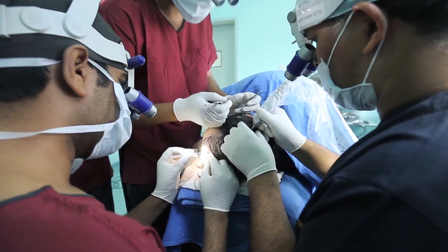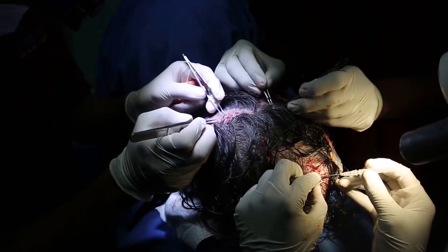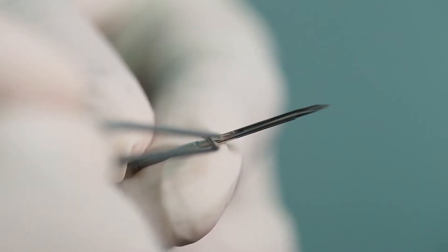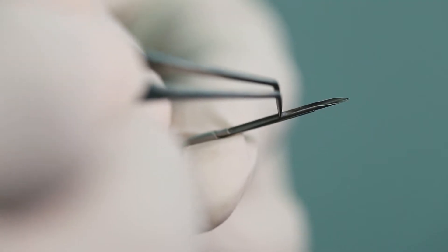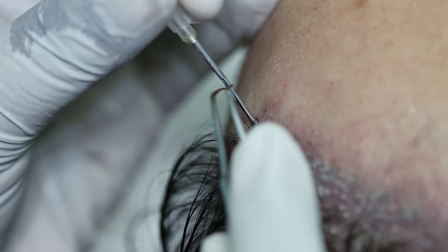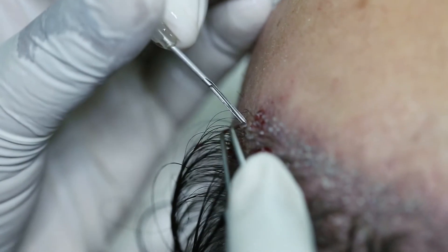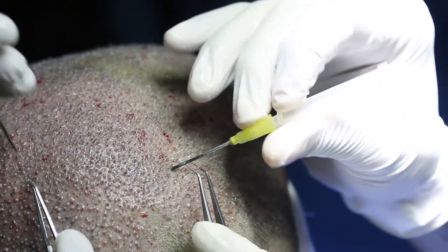Extraction and implantation are performed simultaneously in the DHT technique. The grafts are immediately transferred to the loading area where they are loaded into special implanters. The implanters loaded with the grafts are pushed into the pre-made sites, and the grafts are pushed into the sites from the top very gently. The transit time, or out-of-body time, for the graft is in minutes.